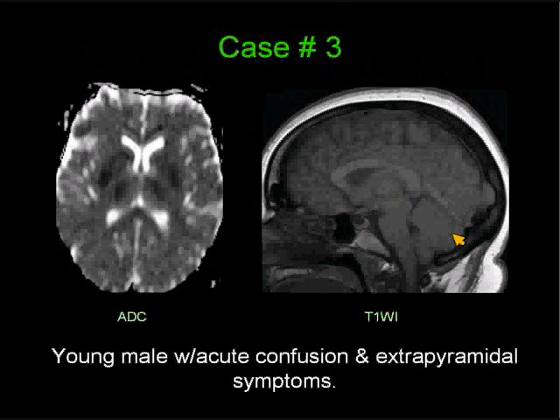Let's go to case number three. This is a young male with acute confusion and extrapyramidal symptoms. I'm showing you an ADC map through the basal ganglia and a mid-sagittal T1-weighted image without gadolinium. Give you a couple of seconds to look at the findings there.